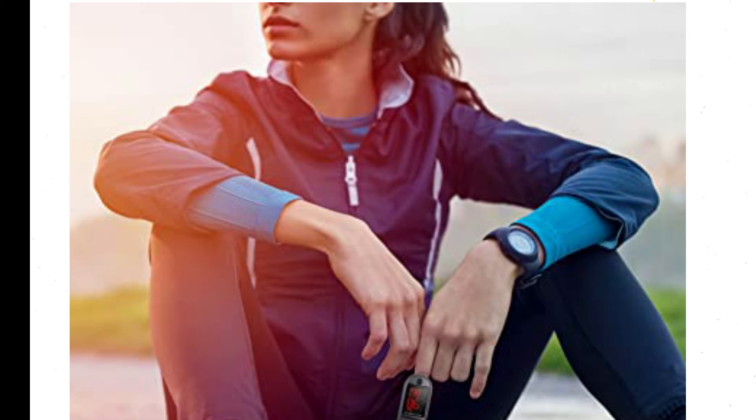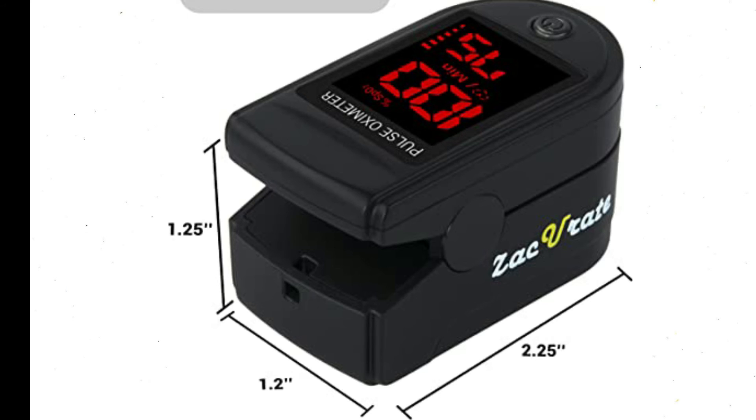Accommodates a wide range of finger sizes with a finger chamber and smart spring system. Works for ages 12 and above. Loaded with accessories — includes 2x AAA batteries that allow the pulse oximeter to be used right out of the box, a silicon cover to protect it from dirt and physical damage, and a lanyard for convenience.